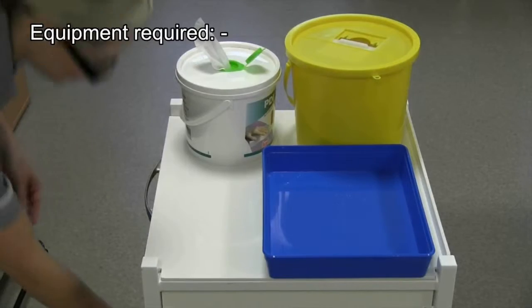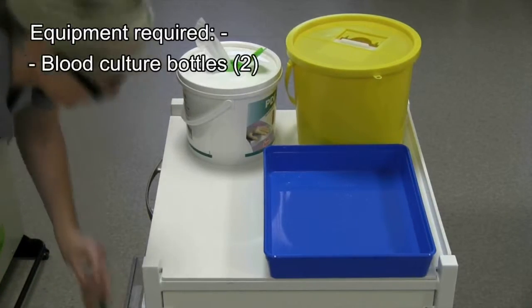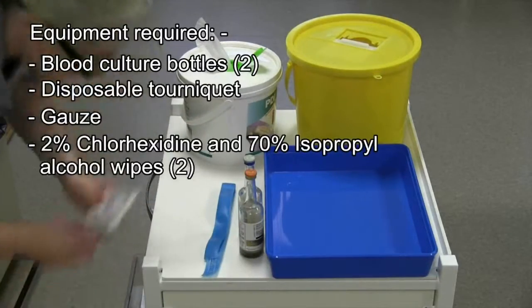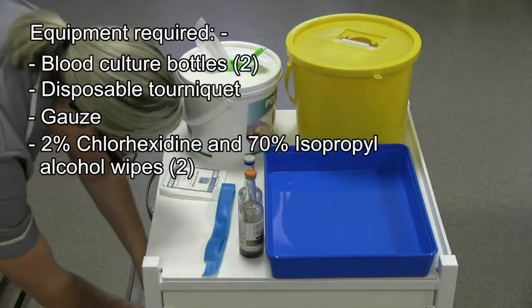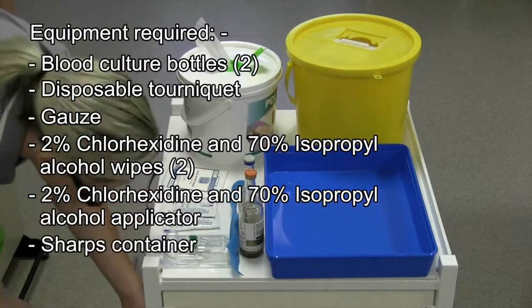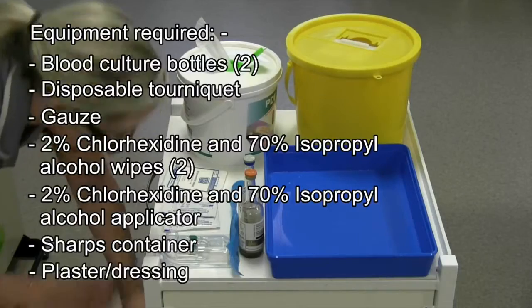The equipment required are: two blood culture bottles, a disposable tourniquet, gauze, 2% chlorhexidine, alcohol wipes, a 2% chlorhexidine alcohol applicator, a sharps container, and plaster dressings.